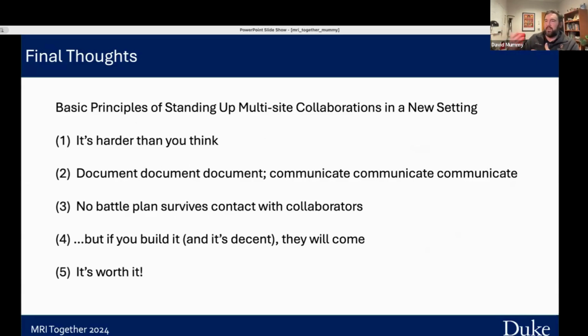For our qualifying scans specifically, some of the sites thought of it as an exam they had to pass. So they would go off and do it all on their own and then send us the scans and wait in trepidation. It would have been a lot easier, we realized, if we'd done it iteratively: send us your DICOMs and we can go back to you and have a Q&A. So don't treat it like an exam. It's an iterative thing you're building together.